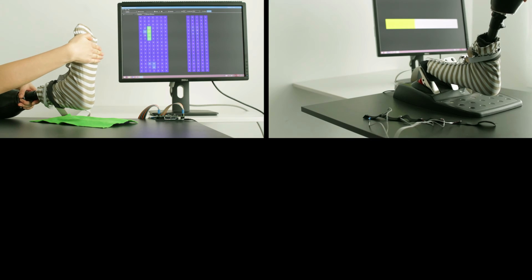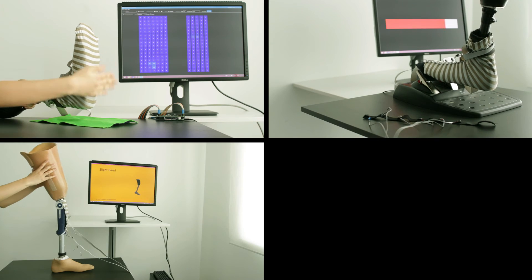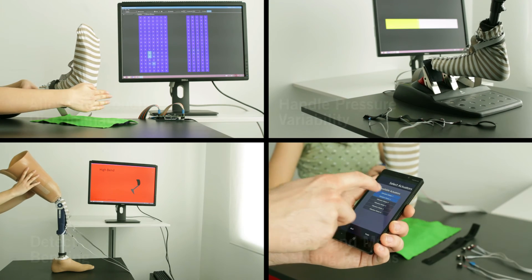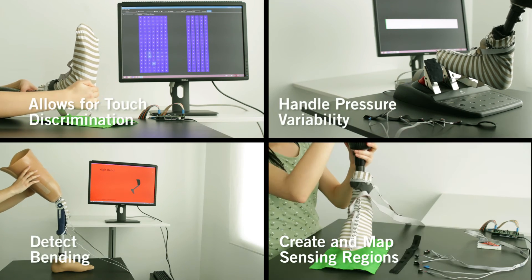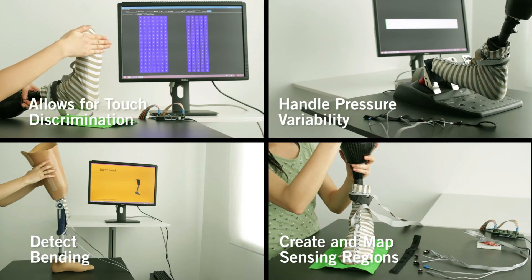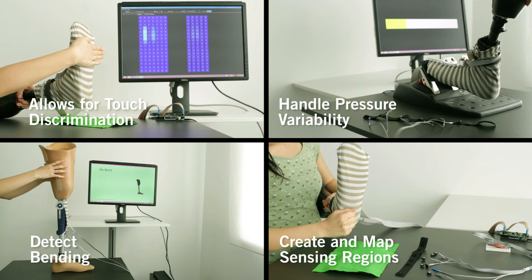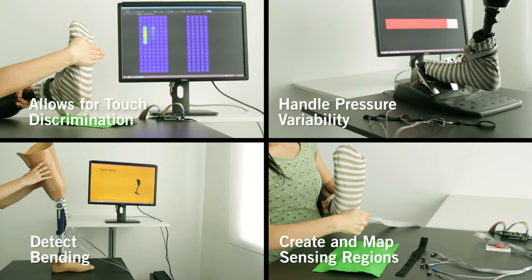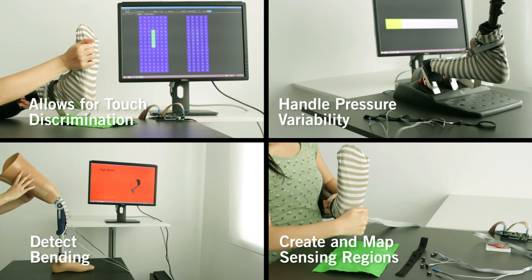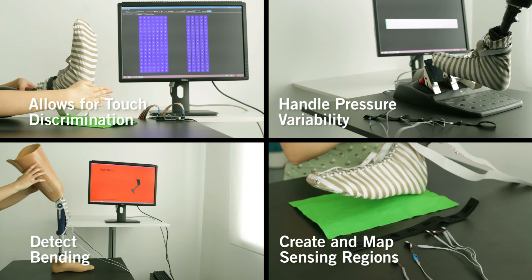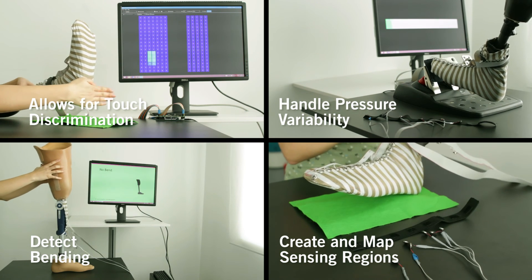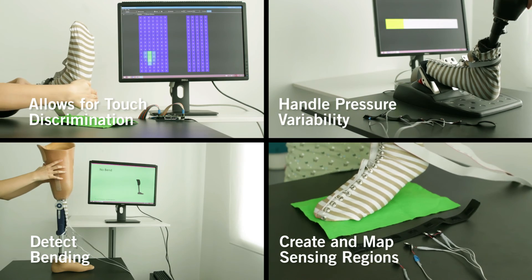ProCover was found to be a promising solution for a non-invasive, self-applicable, cost-effective, and dynamically customizable approach to sensory enhancement of prosthetic limbs.